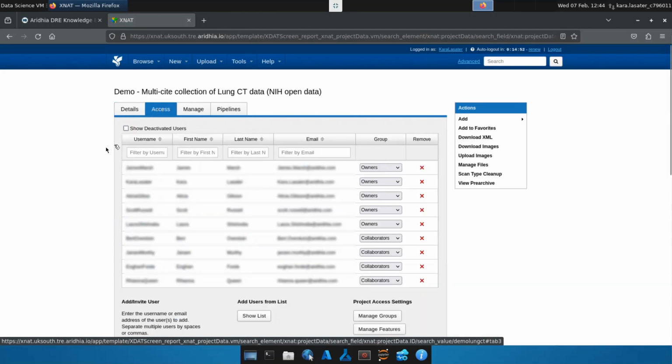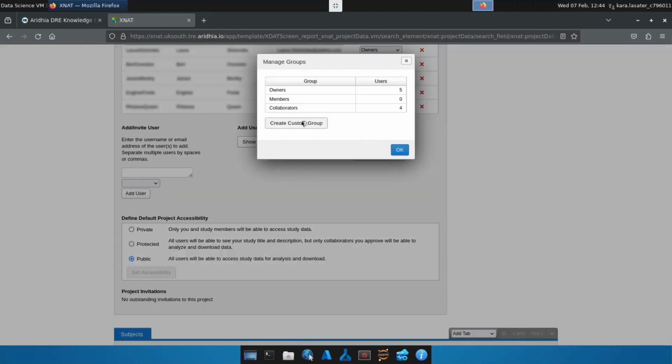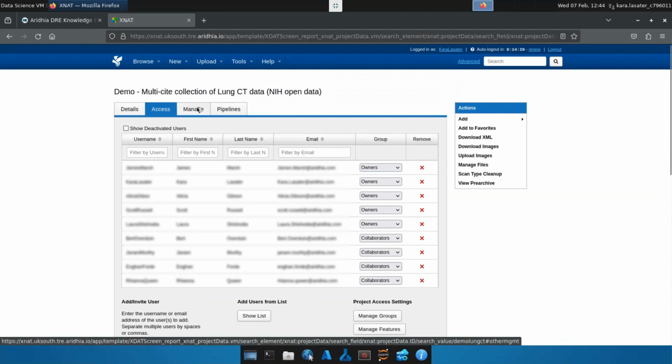They can also define automated access controls to govern researcher access and ensure that sensitive information is accessible only to authorized users. FAIR data services and workspaces work together with audit trails that record who accessed the data, when, and for what purpose. This transparency enhances data governance for data owners and researchers alike.